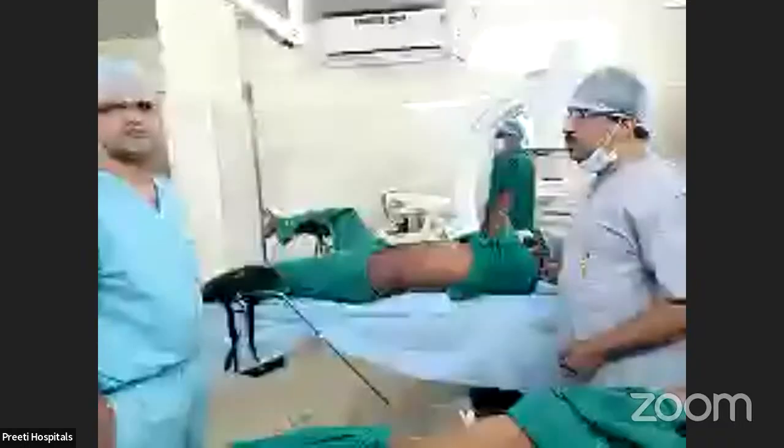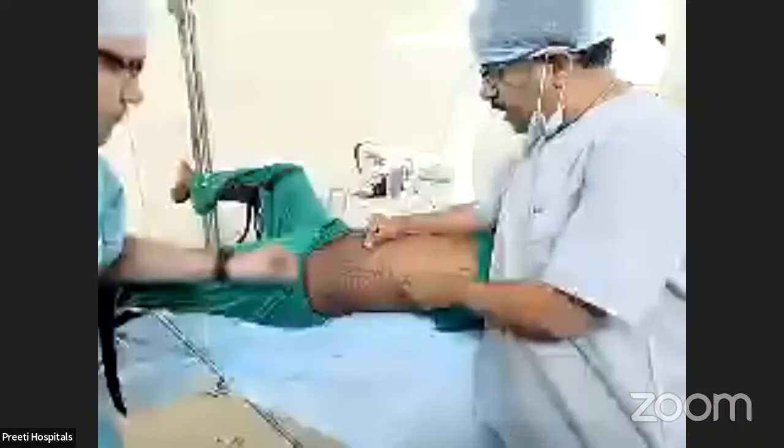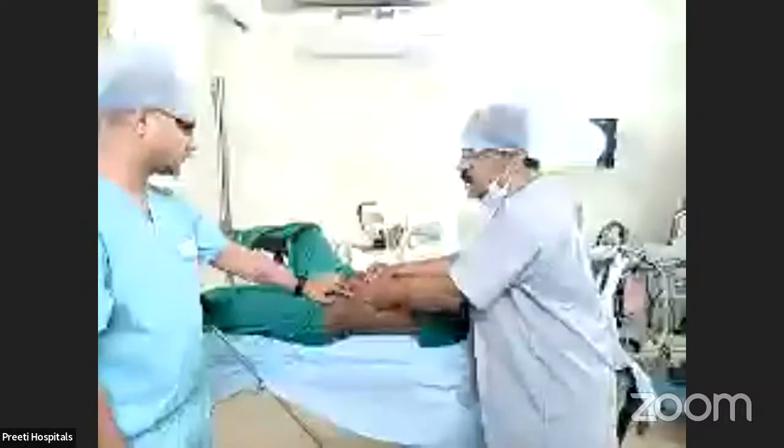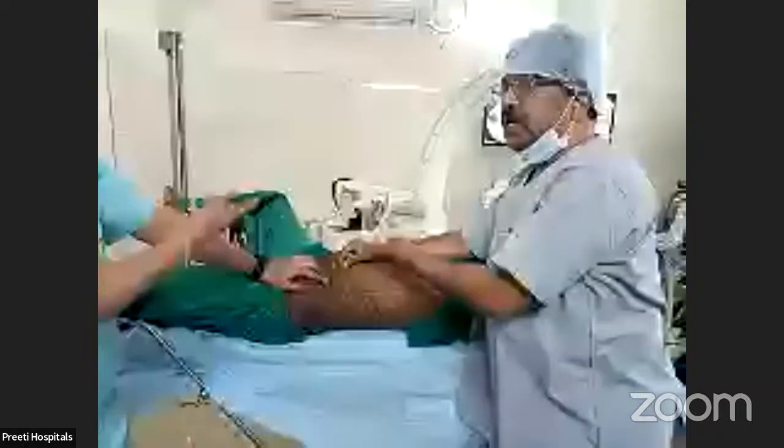Now, we'll continue. If the stone is in the pelvis and two small stones are here, you come through the middle calyx and remove the stone, and these two stones you can remove with the flexible scope. I can go with a small scope from the middle. For small stones, you cannot consider prone PCNL.